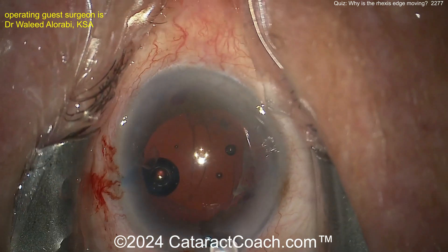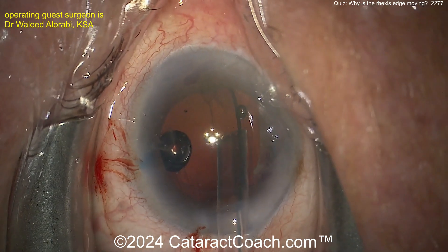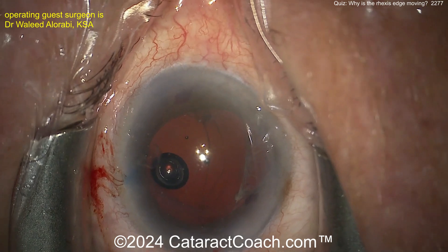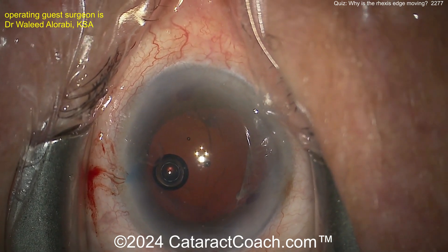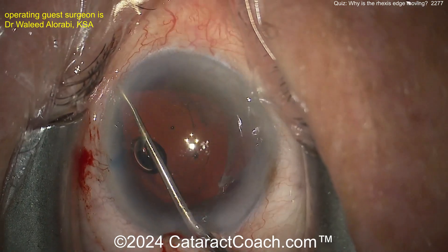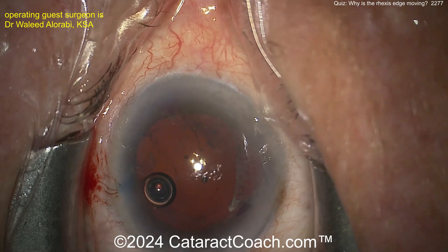More viscoelastic — viscoelastic is your friend, as we know, it's cheaper than vitreous. Now I'm guessing the CTR at this point, or maybe capsule hooks. I'm watching the video for the first time with you. There's the CTR — I like to place it by using a forceps to hold the leading eyelet and putting that in. That should help a lot. Now just make sure it's in the bag — yeah, hopefully it is.